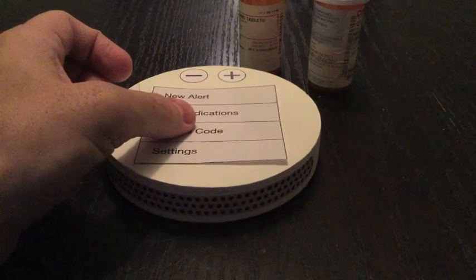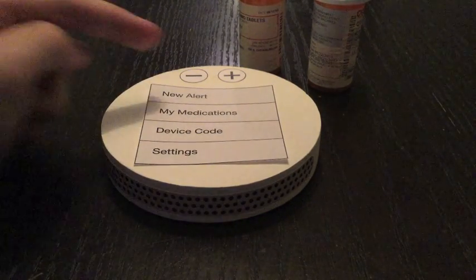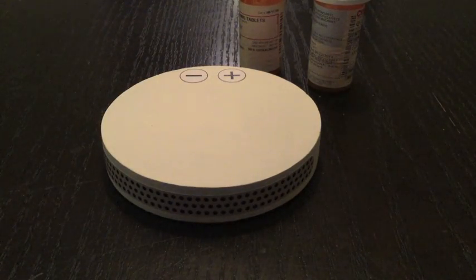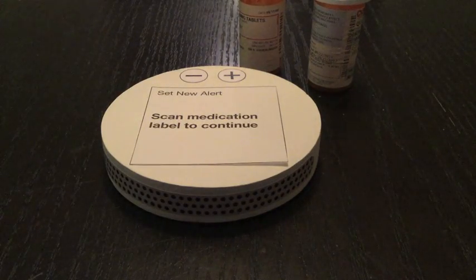This would take them to their main menu. From their main menu, they're going to click the New Alert button. This takes them to their Set New Alert screen. They are prompted to scan the medication label to continue.